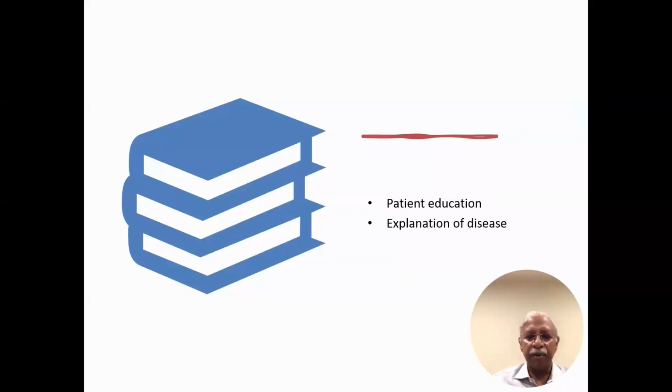It is very simple for us at the terminal, the consultant, to show the picture to the patient, the one that he or she has got, the disease process, and at the same time pick up a normal picture from another patient, a normal fundus, show the difference, and tell them why we are asking them to undergo further evaluation and tests. That's very, very useful for us.